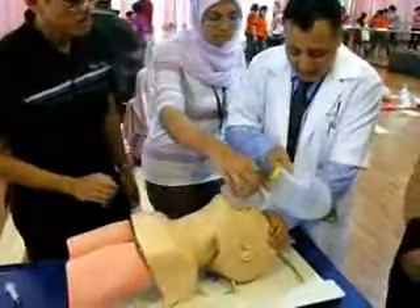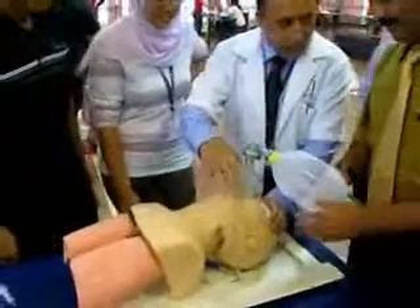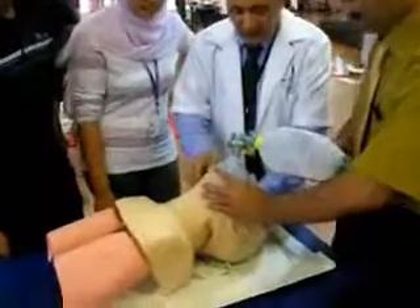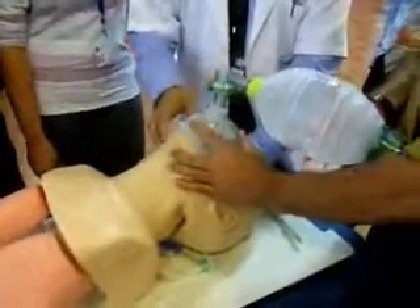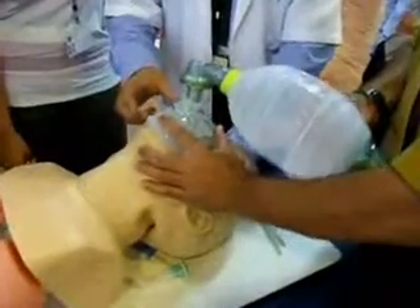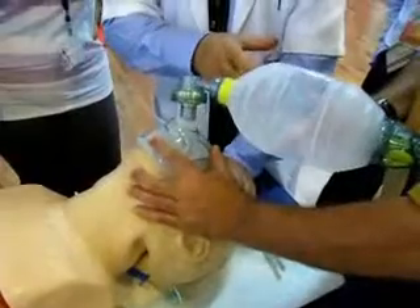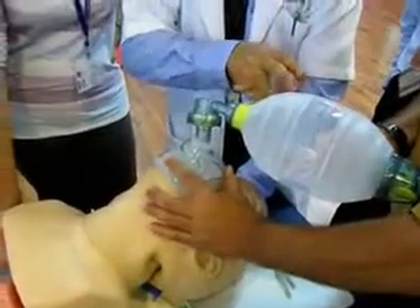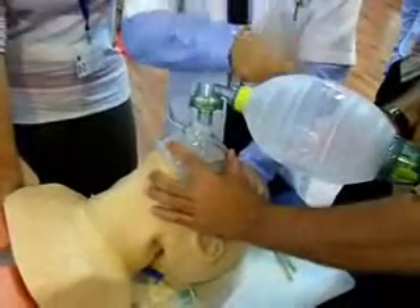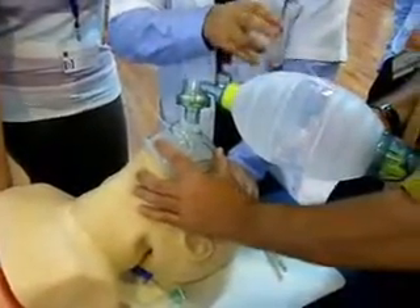Before endotracheal intubation, give some oxygen to the patient by giving about 8 to 10 breaths per minute. This can be done by counting: 1, 2, 3, 4, 5, 6 — repeating the count to maintain the correct rate. After giving some breaths to the patient, you can take off the ambu bag.